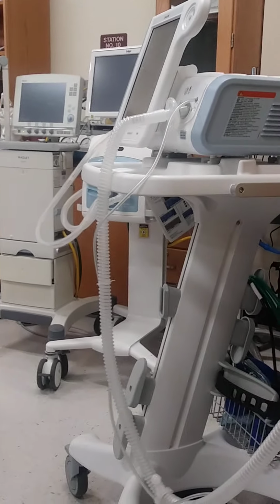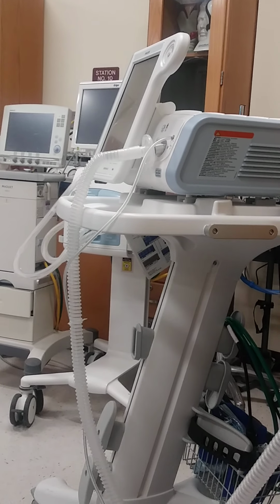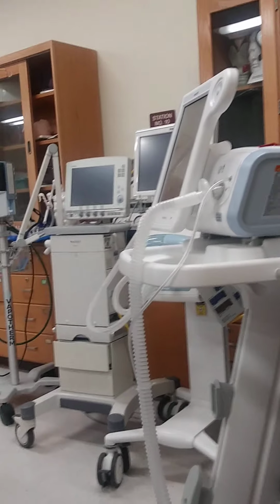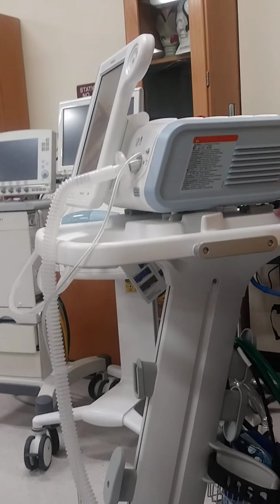How to treat people with additional oxygen devices, right? Should they be in distress or should they have issues with hypoxemia, right? So everybody knows their indications for oxygen therapy, right? So documented hypoxemia, what else?